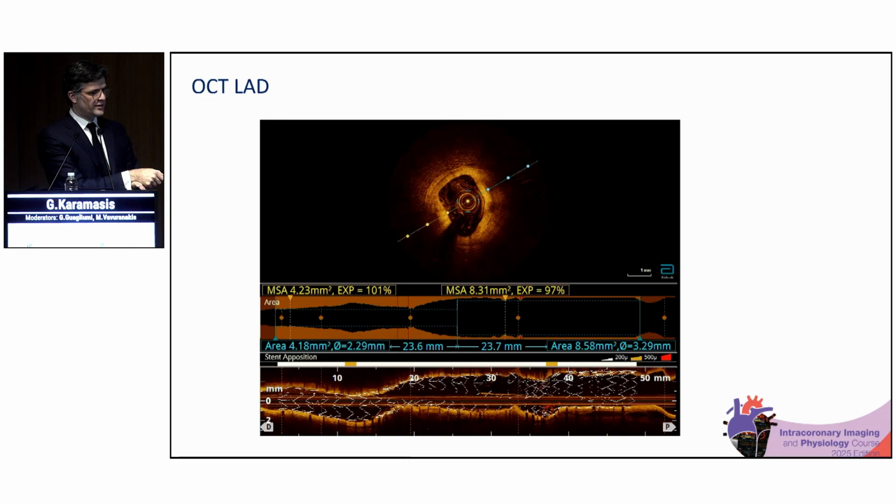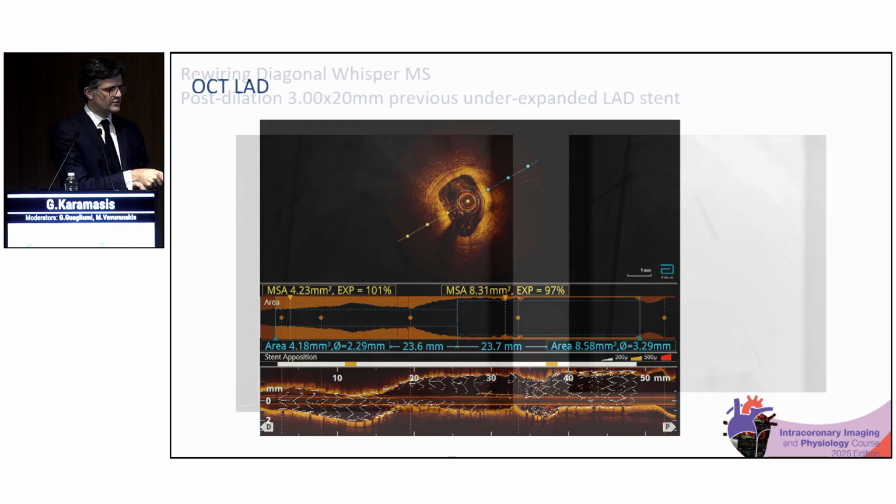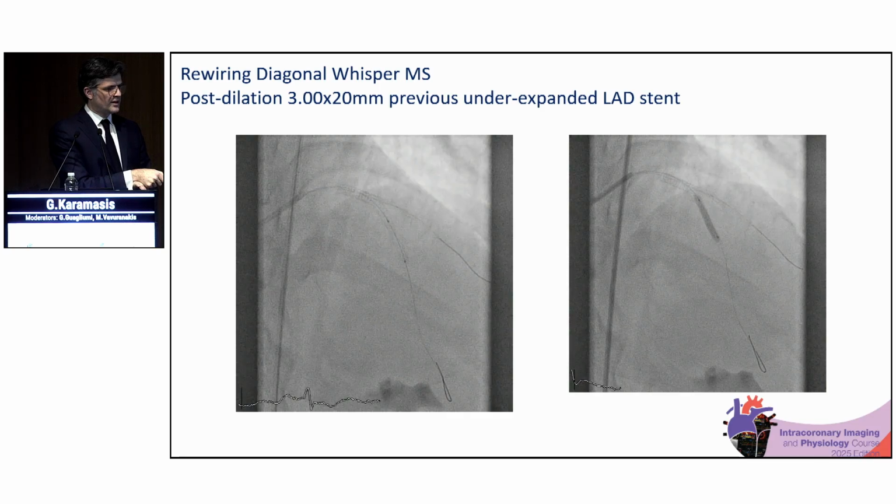And then we did another OCT run. I don't know, Julie, if we can skip this, or do you want to show this too? Going to the last one? We can go to the last one, maybe just to save some time.